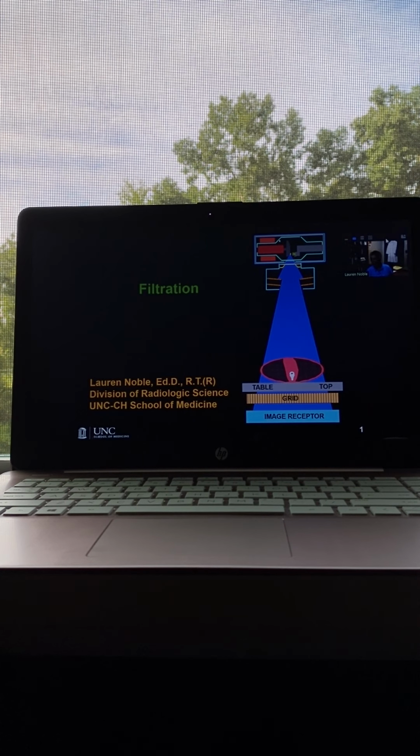It can be made of metal. Ours typically are made of glass. So it's that glass envelope, and that maintains the vacuum so that the electrons will be able to make it from the cathode over to the anode. And then the anode is connected by an anode stem. And do you remember what that anode stem is made of? Begins with an M. Molybdenum. Yeah, exactly, molybdenum.